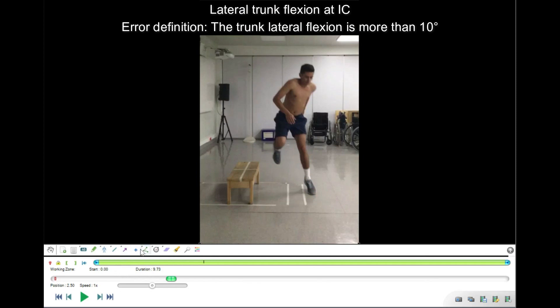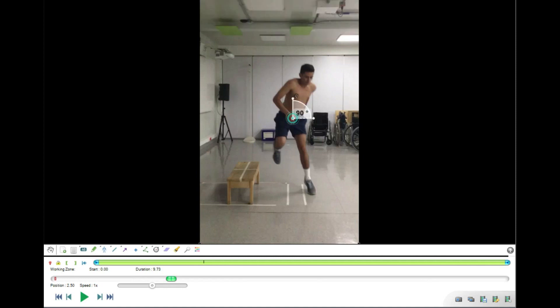The next item is lateral trunk flexion at initial contact. We use the angle measure, placing the cross in the middle of the pelvis close to the symphysis. The tool draws a 90-degree reference and we measure the angle between vertical and the participant's trunk centerline, aligning the other line with the sternum along the midline of the trunk. The reading is 22 degrees. An error is present when this angle is more than 10 degrees, so in our case — 22 degrees — the error is present.